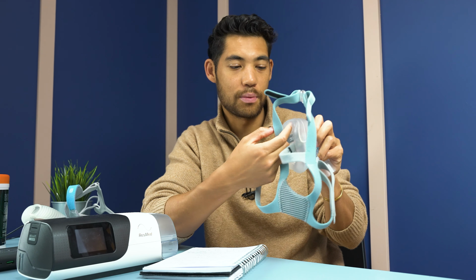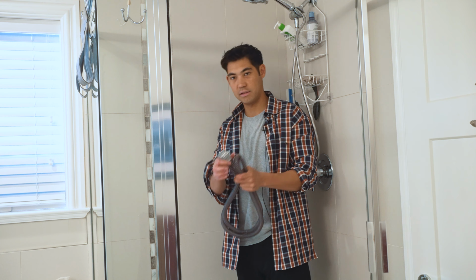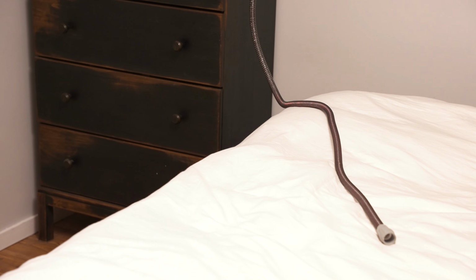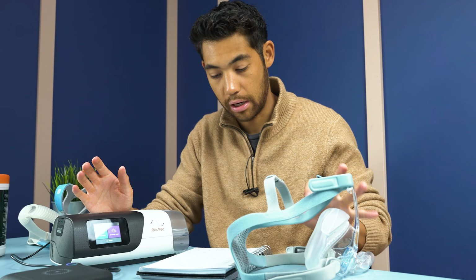Now, in terms of your weekly cleaning, you want to be deep cleaning your mask, your tube, and your CPAP machine, mainly the water chamber. You're going to be using vinegar or dish soap to do that. I have a video on cleaning, I'll put it down below. Basically, rinse everything out, let it soak, wipe it nice and dry, and then let everything dry nicely. Clean your tube with a tube brush and then dry it out using the CPAP machine. Just make sure you're doing that once a week, and then doing your little daily wipes with some citrus disinfectant wipes every day.